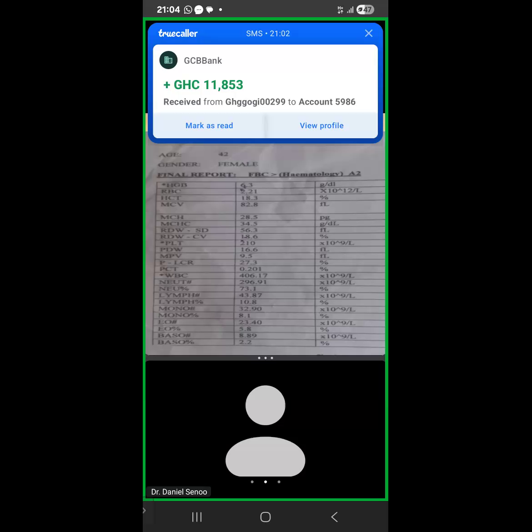So what I will see, I need to know the size, shape, and color, and sometimes abnormalities of the RBCs on the smear, and also look at the white blood cell types, like neutrophils, lymphocytes, and their morphologies. And then the platelet count as well on the blood smear that I prepared. My question is not answered, please.